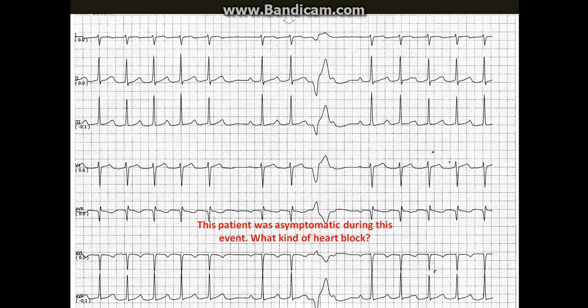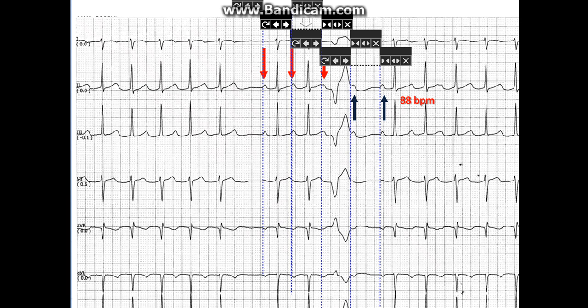First, I look to search for the P waves. I use the P-to-P interval to march out the P waves, which are marked with blue arrows. From there we can march backwards or forward, and the atrial rate is about 88 beats per minute. It is obvious that some of the P waves are buried in the T waves or are hidden from view.